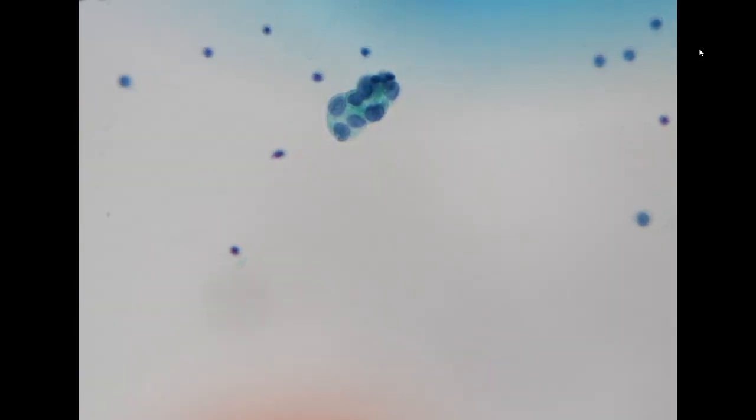Again, this is her second specimen. Also, this very tight cluster forms a tubular structure. The cells are slightly enlarged. The chromatin pattern is quite homogeneous, quite uniform. We only see a very, very small nucleolus over here, and that's it. So we call these suspicious. I think this is positive, but they can go ahead and do a biopsy or something like that.